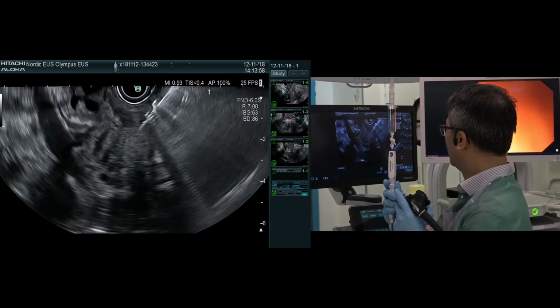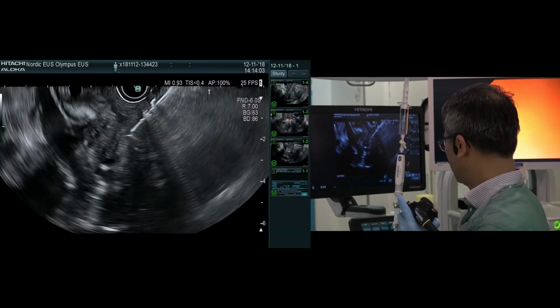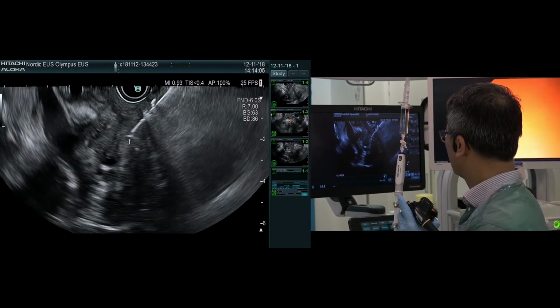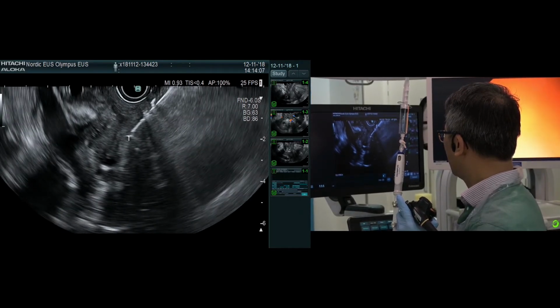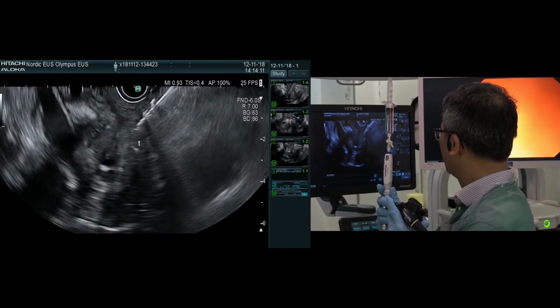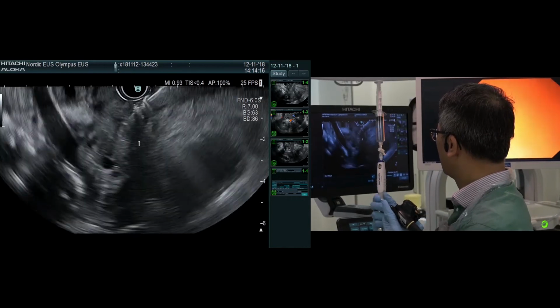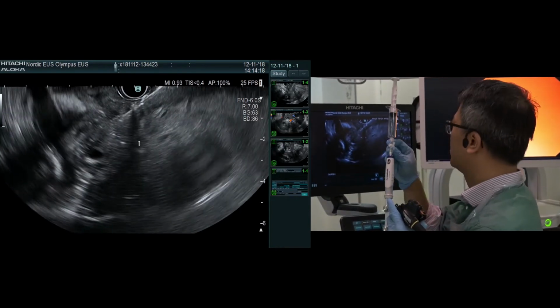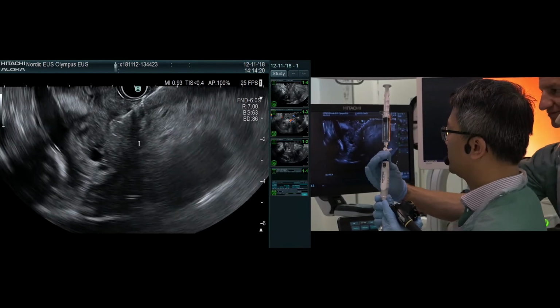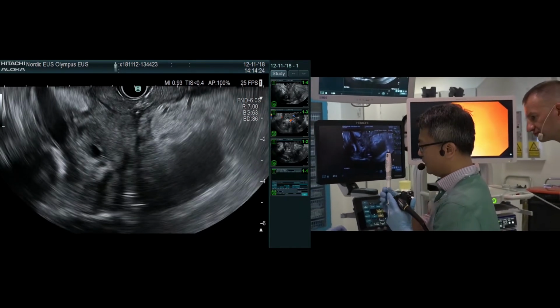I try to keep an eye on the tip of the needle. There's like a dot. If you see here, this is what I call the guiding star. So as long as I have an eye on that, I know more or less where I am. Okay, so now we close, disconnect, and then we remove everything.